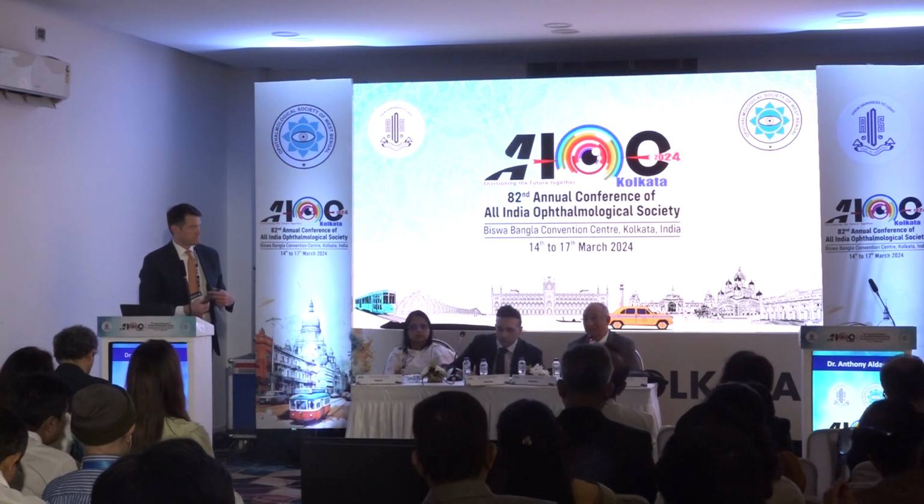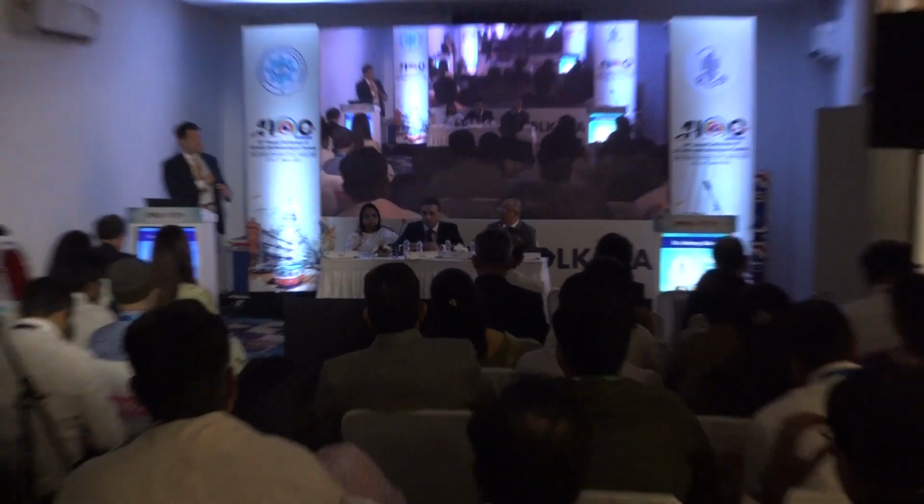Thank you, Dr. Aldave, for giving us nice tips for a deep chamber. Opening the DMEK roll is so difficult most of the time. In the last video, there was a single point hole in the DMEK roll. Will that flip sometimes inside the anterior chamber with the fluid on? Shouldn't flip. If the fluid infusion is controlled, the graft should not flip upside down, for example. It may crumple up, but as long as you still have a hold on it, you should prevent it from being able to flip over.